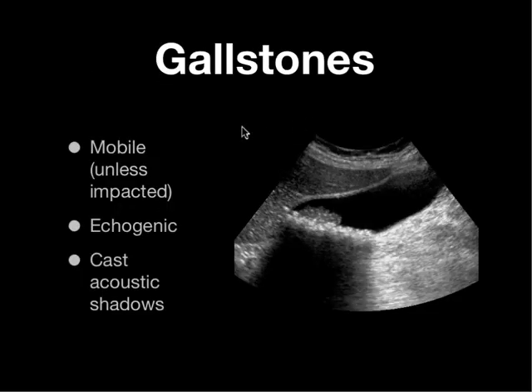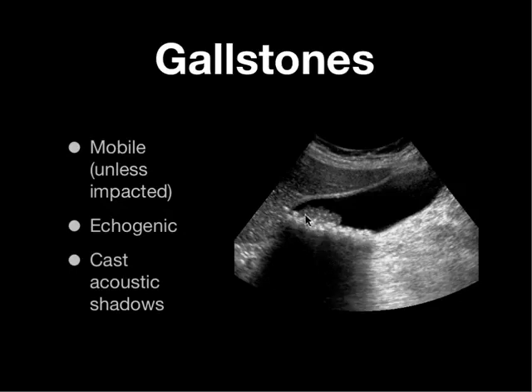What are gallstones going to look like? Unless they're impacted, they're going to be mobile. If you see gallstones, especially by the neck, you've got to do the exam in two positions to confirm mobility. They're going to be echogenic and they're going to cast clean acoustical shadows. Here you have a gallbladder that has multiple echogenic stones with clean shadowing behind it, and there's a sludge ball sitting on top. But these are all gallstones.